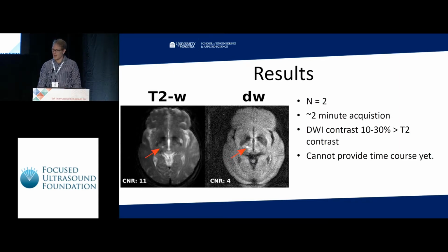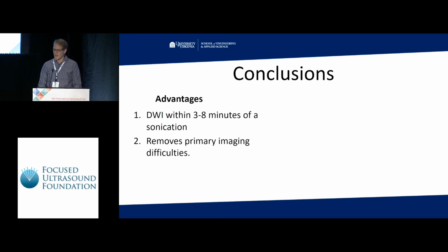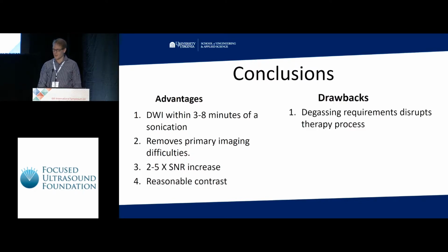So the advantages of this technique of draining the water bath is that you can acquire these images fairly rapidly after sonication. Draining the water bath does remove the primary impediments to diffusion-weighted imaging, and it also gives you a large increase in your signal-to-noise ratio, and the contrast so far seems to be reasonable.